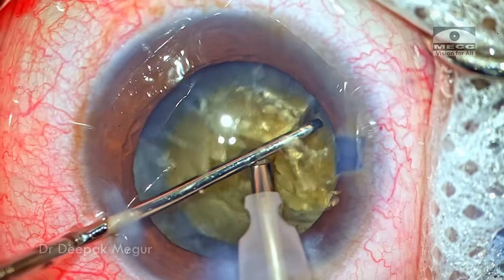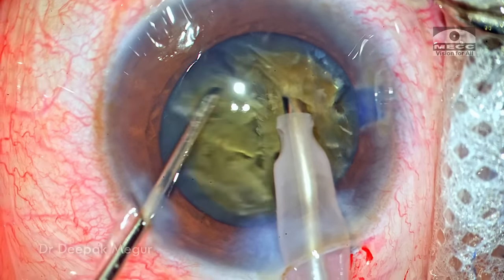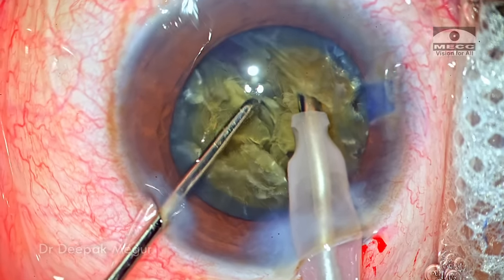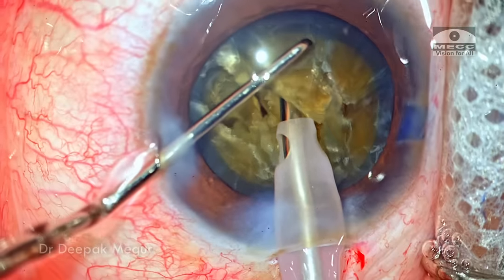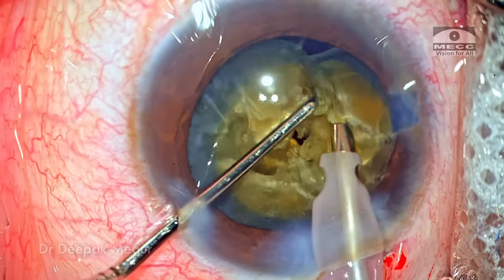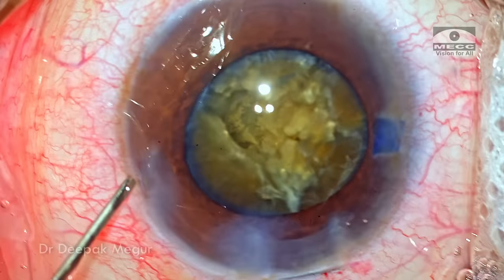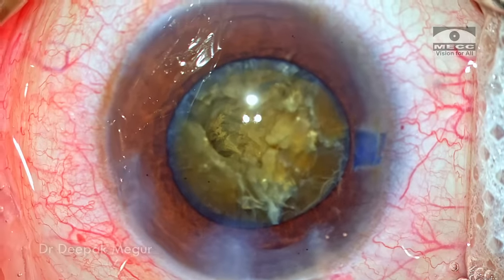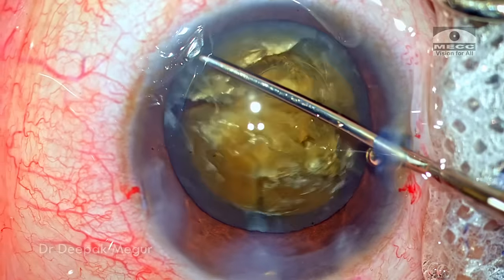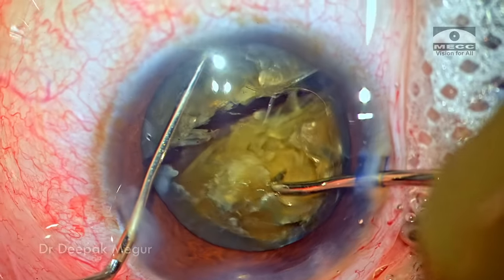Time to perform the chop in the adjacent fragment — the tip is buried and I'm doing the lateral separation maneuvers. This was a central thick posterior plate, and you can see how thick and tenacious it is. It's going to take a lot of patience and perseverance to eventually break this posterior plate attachment. The iris is trying to come out through the side port, so I inject a little phenylephrine to ensure the iris behaves better, and replenish the OVD. Using a Sinskey-type chopper I confirm the posterior plate is well and truly cracked and we have two distinct hemi-nuclei.